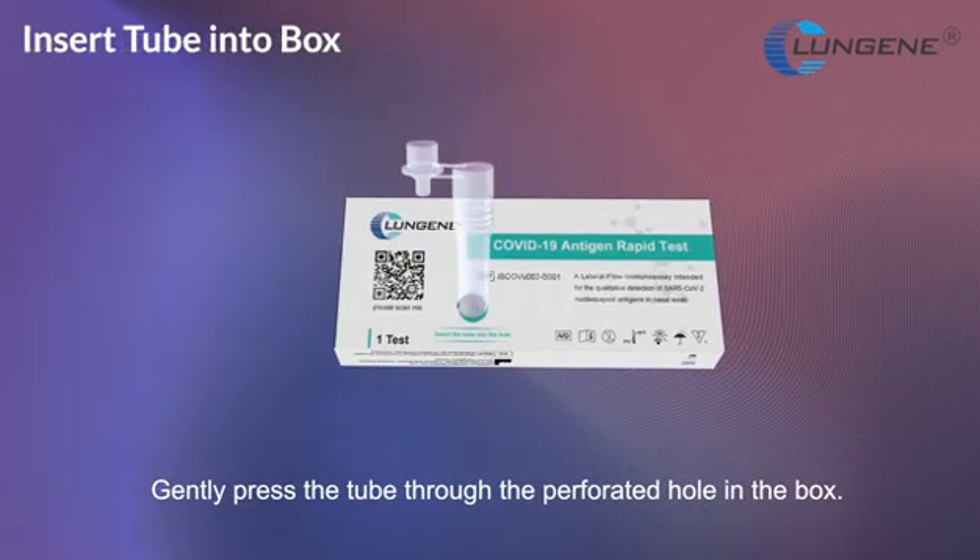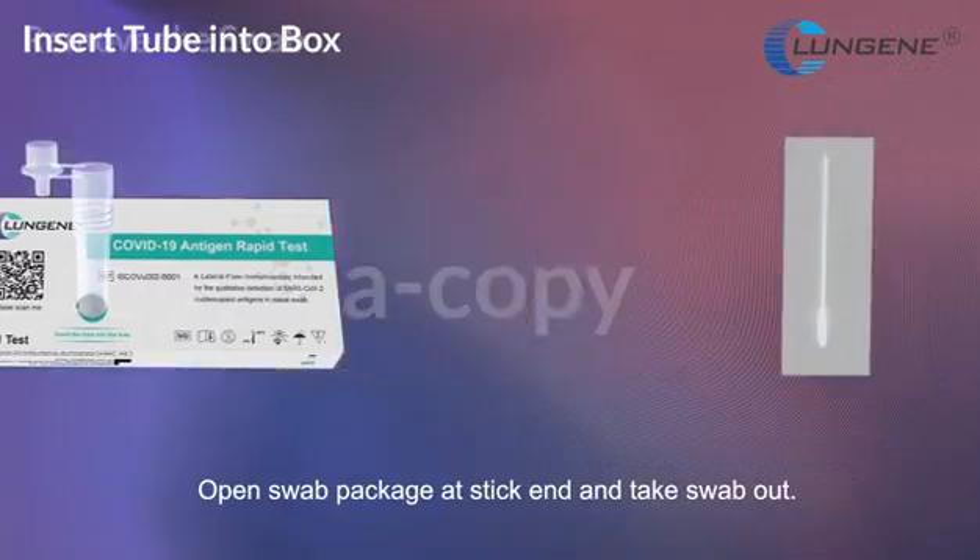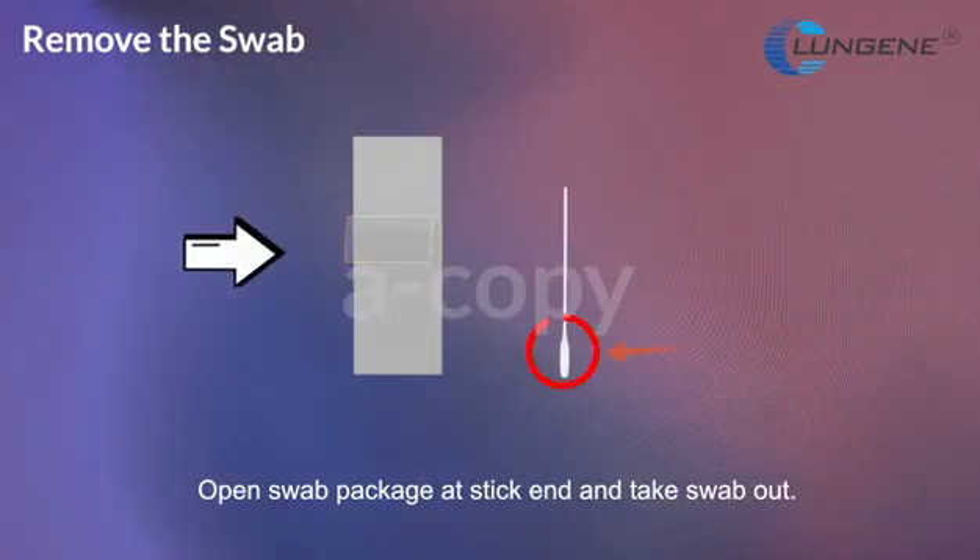Gently press the tube through the perforated hole in the box. Open the swab package at the stick end and take the swab out.